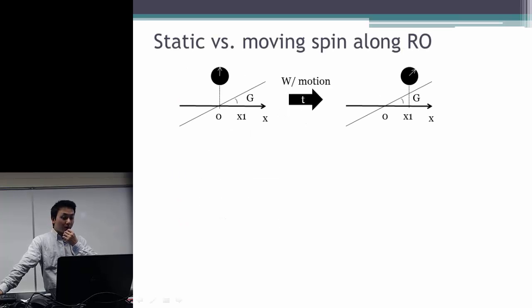Okay, so up to now, when we are talking about imaging the object, we are talking about imaging a static object. That means we always assume that every point of that object being imaged remains at the same location throughout the whole scan. So what we call is the static object or static tissue.